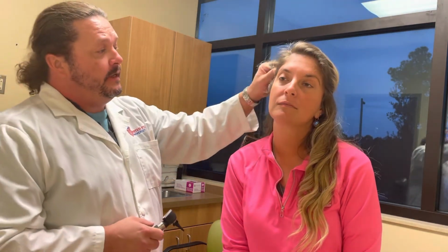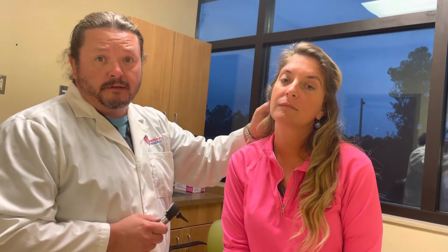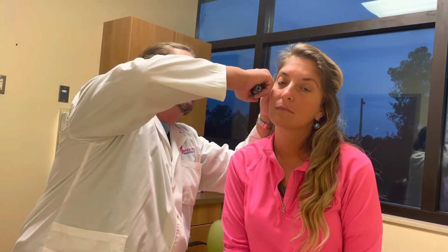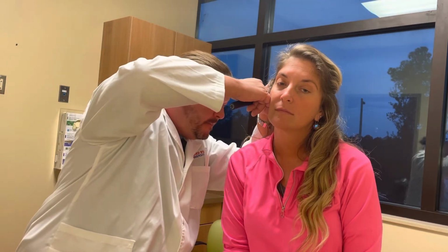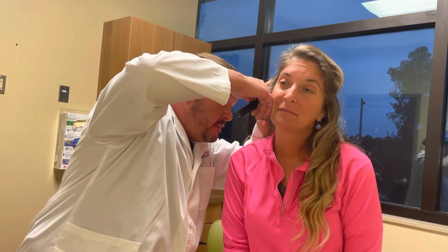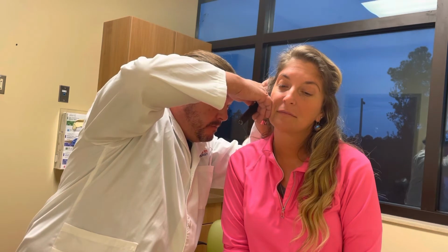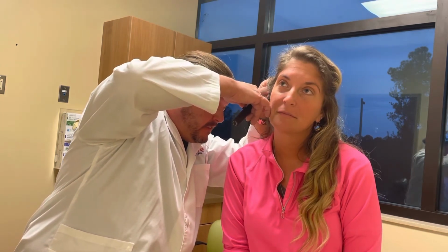Okay. So again, I've palpated that tragus and that pinna, and I don't see any redness on the external auditory canal that I can visualize from this point. So I'm going to go ahead and grasp the earlobe and retract that back. And again, I'm bracing so that I'm not jamming this into her ear canal. And we're taking a look, and I see a cone of light, and that is at 5 o'clock where it's supposed to be. I also see the anatomical landmarks, and I'm advancing the speculum out.